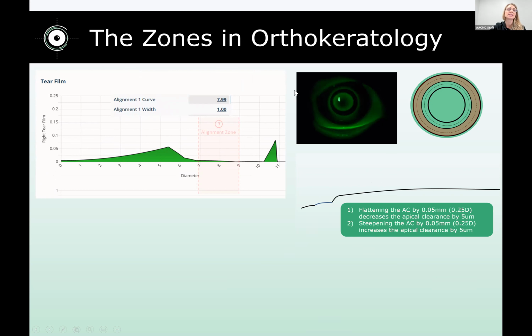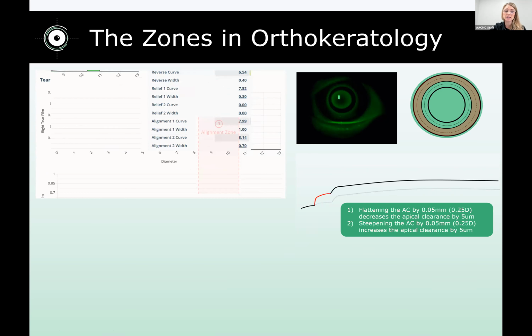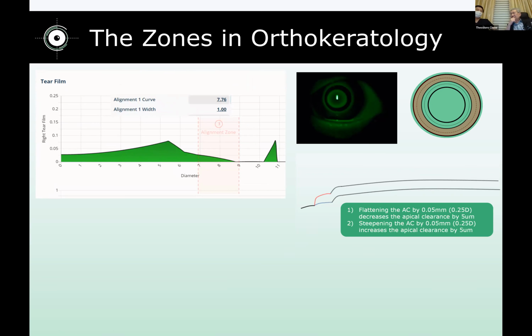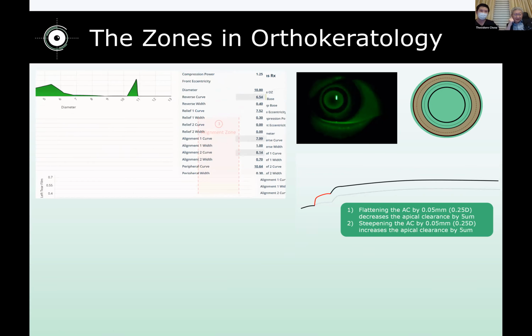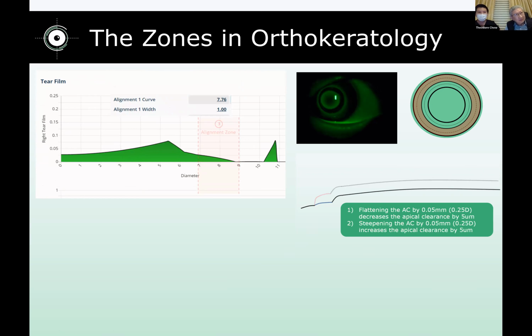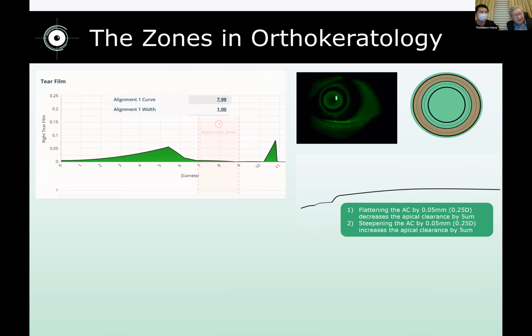How does increasing the AC2 tear layer thickness affect the fluid seal under the lens, and or does it loosen the fit? I would think that does loosen the fit a little bit. I would suggest it does loosen the fit a bit. The fluid seal, I'm not too sure about this fluid seal. I don't think I can answer that question well.